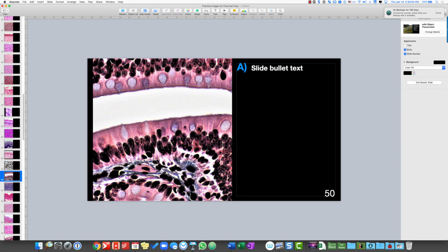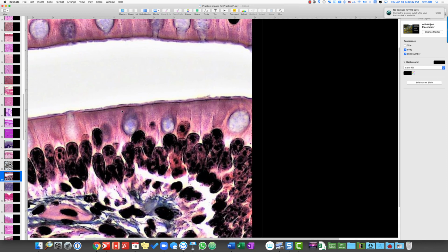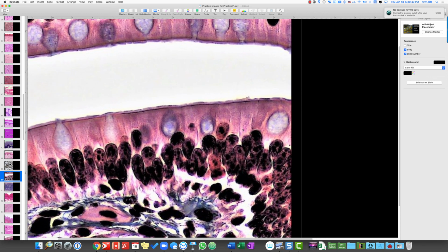Okay. Another thing I want to note is that sometimes what you're seeing here could be just you're looking at a few layers of cells sort of stacked on top of one another, and so you're looking through cells over one another, and so it's possible that these are just nuclei that are in different planes. Okay, I don't know if that makes sense. Anyway, these are microvilli. You can see they're pretty uniform in contrast to the cilia, and these are goblet cells.